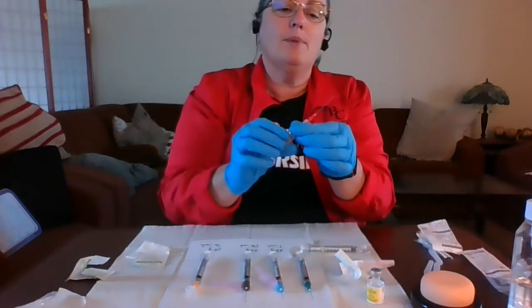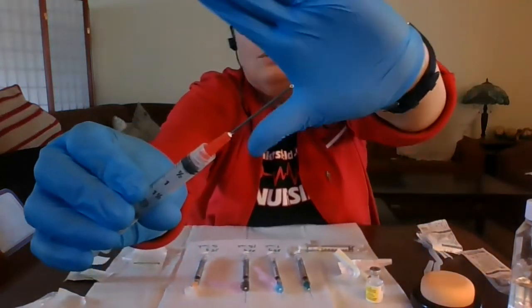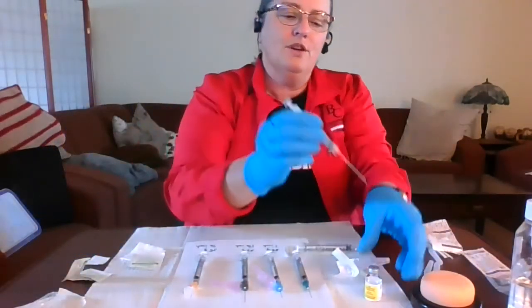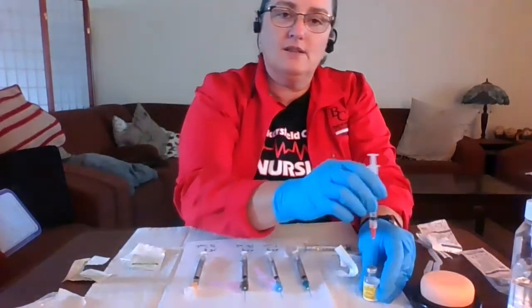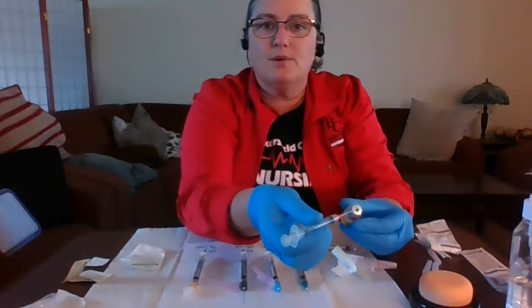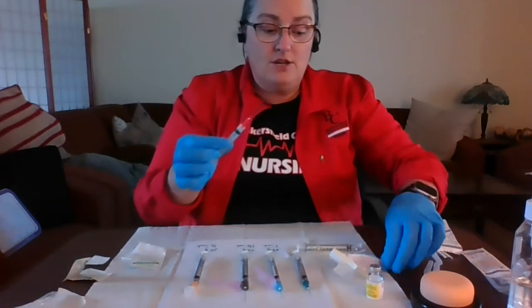It does have a bevel, which is the area at the end of the needle where you can see the opening. So that's the bevel. And we do prefer to have the bevel up when inserting into the vial. It prevents the coring of this rubber tip. This is only to be used to draw the medication up.